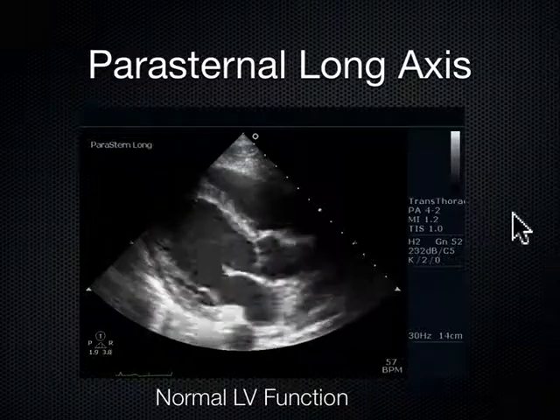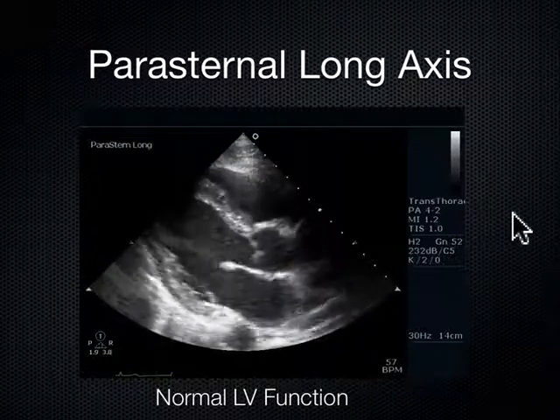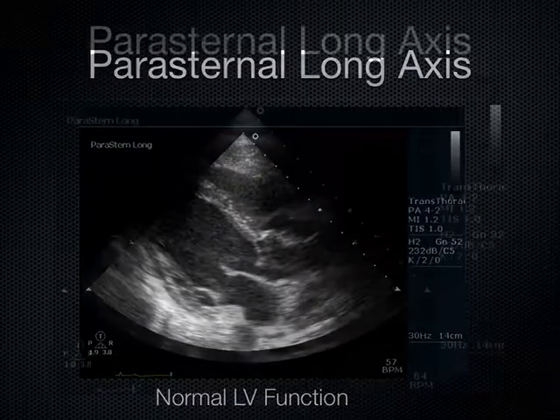Quantitatively, I think the cardiac output stuff we're about to do, very useful. Ejection fractions, I don't know. I just like to look at these hearts and decide what I'm going to do next.